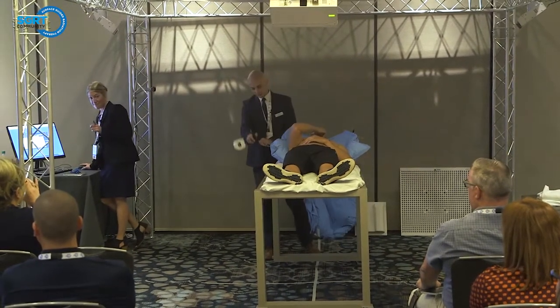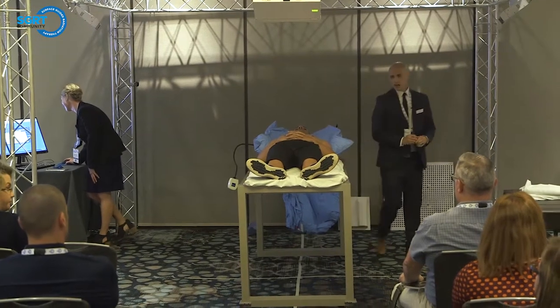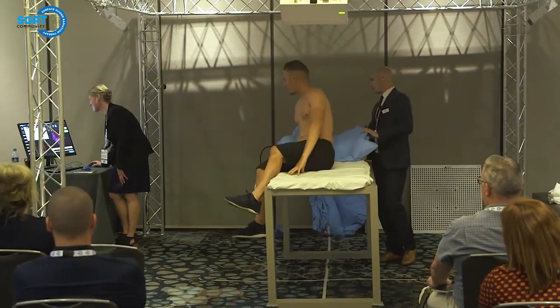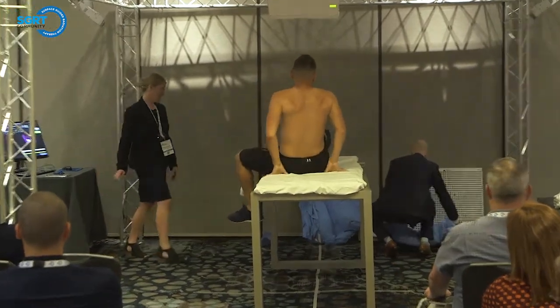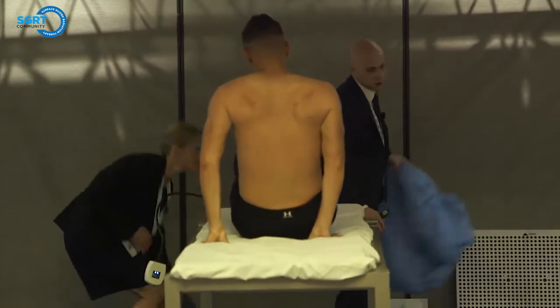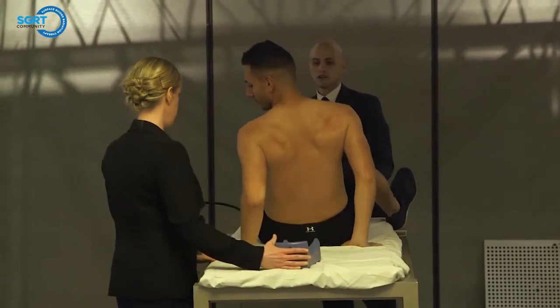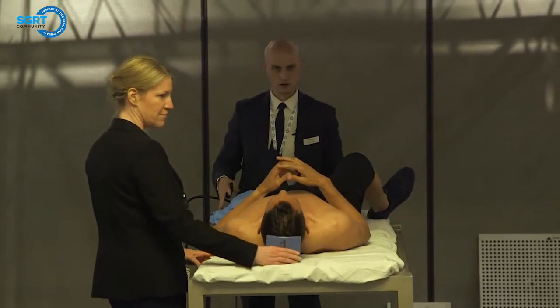So again, we can't move our table like we normally would in the clinic, but what we want to set up, you can go ahead and set up, Tim, and switch around. We're going to work on setting up an extremity, okay? And this session is going to be based solely on our rotationals, okay? An extremity, has anyone ever set up an extremity with the surface guided system before?